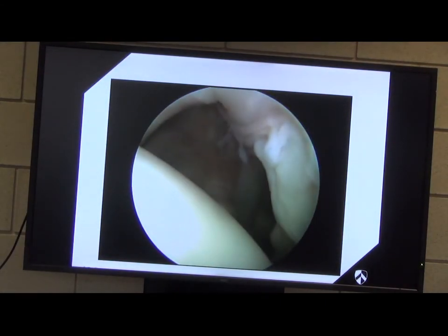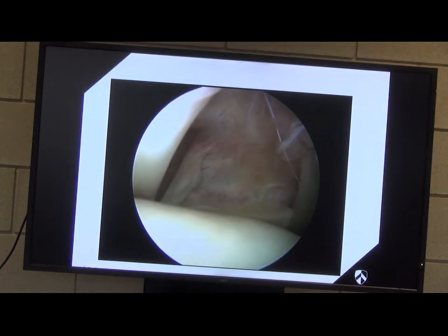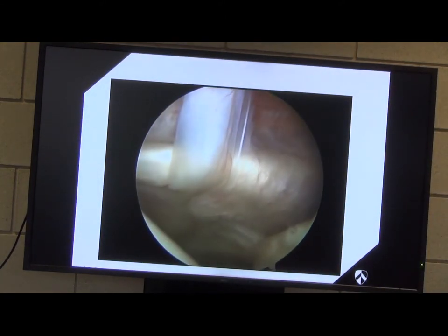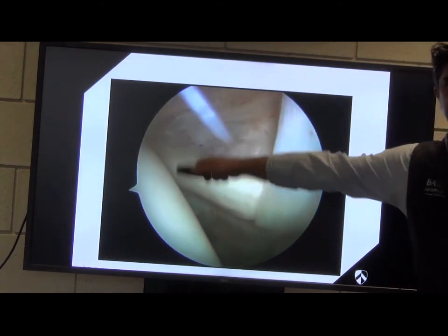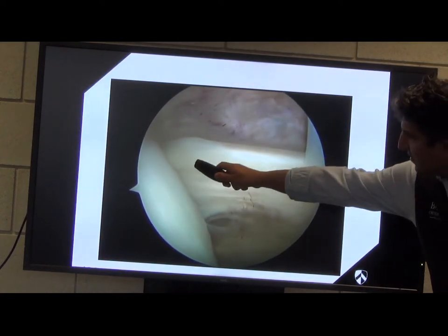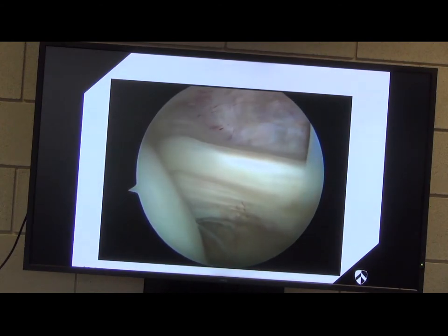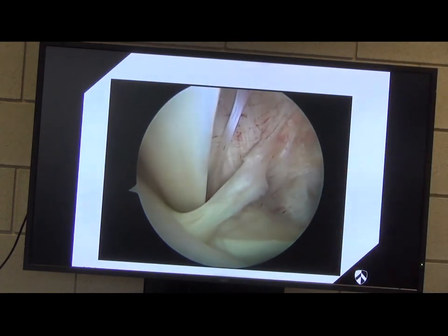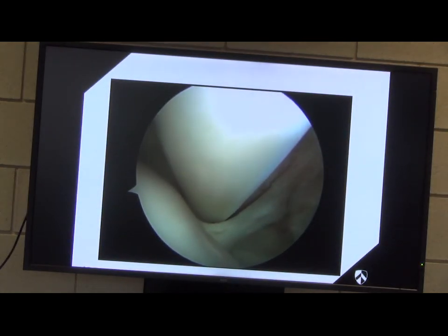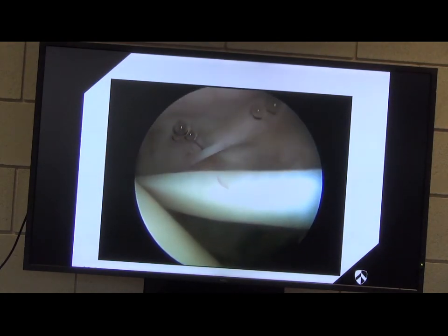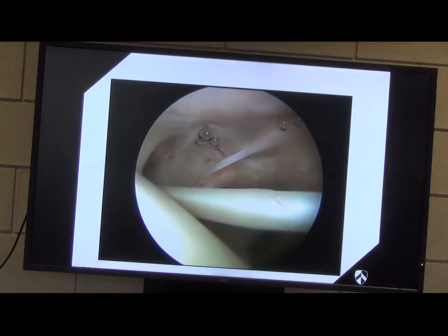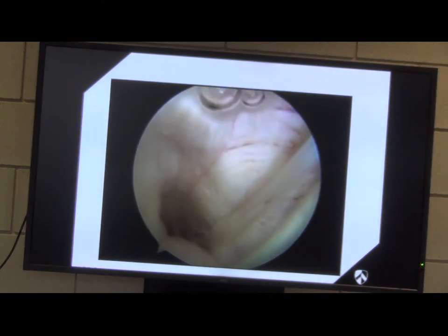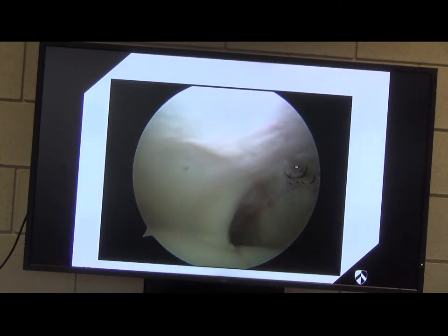So, diagnostic arthroscopy — again, left shoulder. We're going into the rotator interval, looking at the long-headed biceps, the pulley tissue, the subscapularis. If you have a subscapularis tear, it will often tear at the top first and then extend inferiorly. The superior cable of subscapularis is the thick part of the subscapular tendon. If you tear that, the pulley tissue by definition also gets damaged. Therefore, if you're repairing the subscapular tendon, you must do something with the biceps, because it's going to be running over your repair. What we usually do is either tenotomise it or do a tenodesis — releasing it from inside the joint or on the outside of the joint.